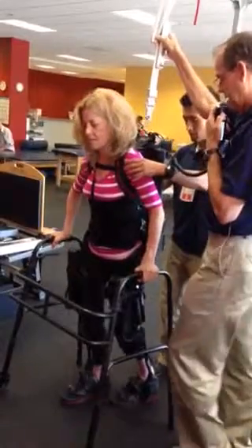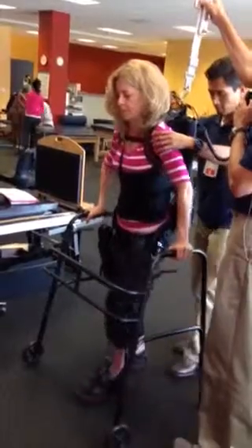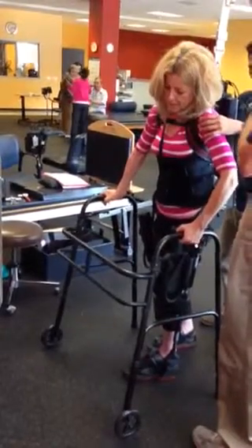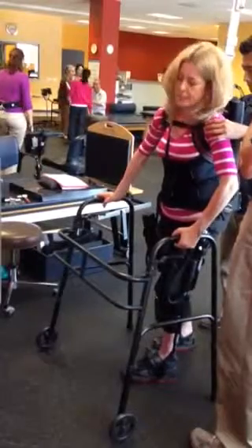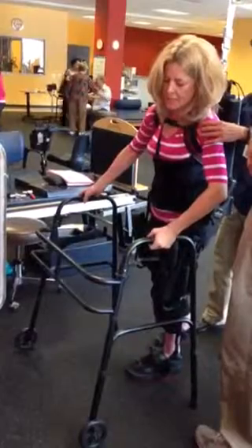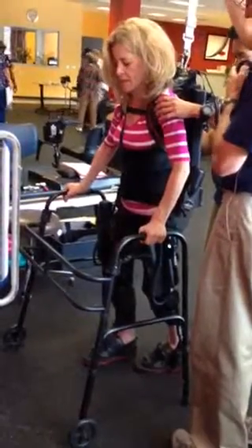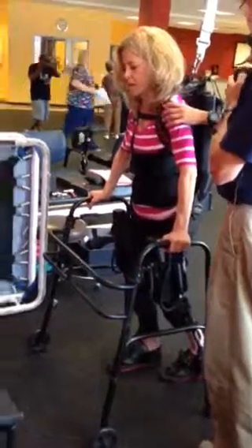Good. Now lean right. Nice. Right there. Step. Push that walker forward some more. Lean left. Use that right hand to help you. And forward some more. Lean left. Right there. And right there. Hold it. Step. Good. To the right and forward. Right there. Step.